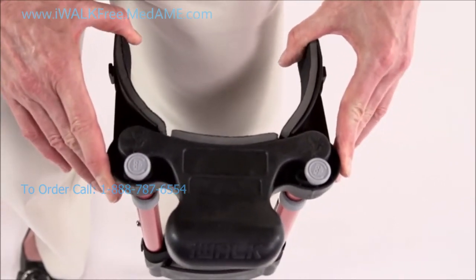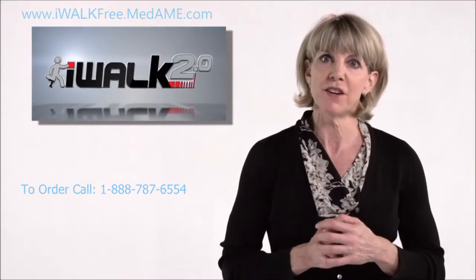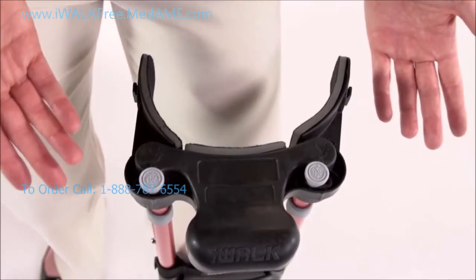If they slip, reset them and check them again. Also, if your thigh supports are adjusted asymmetrically, that's perfectly normal for many leg types.